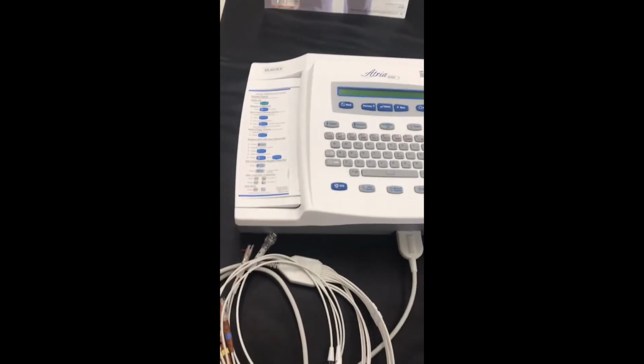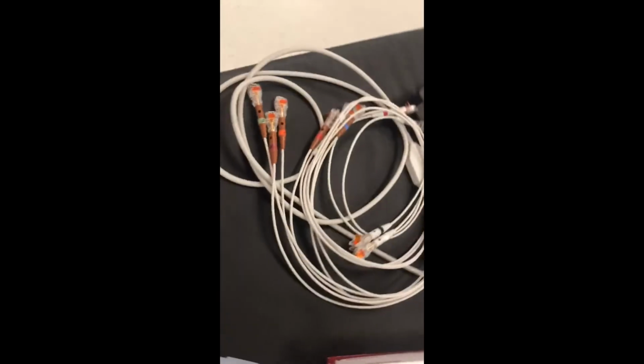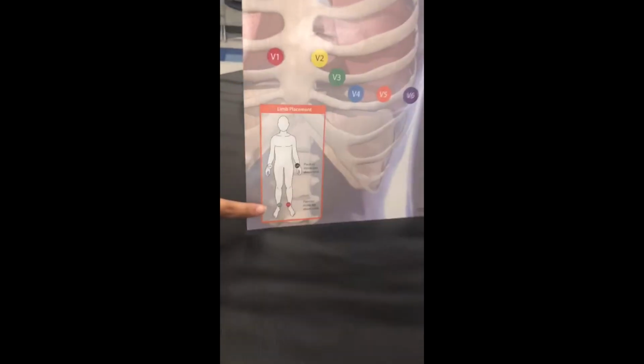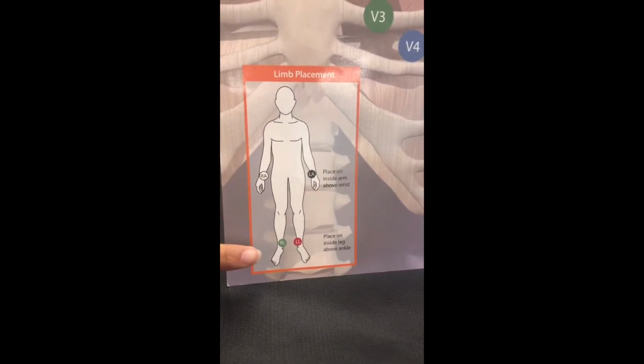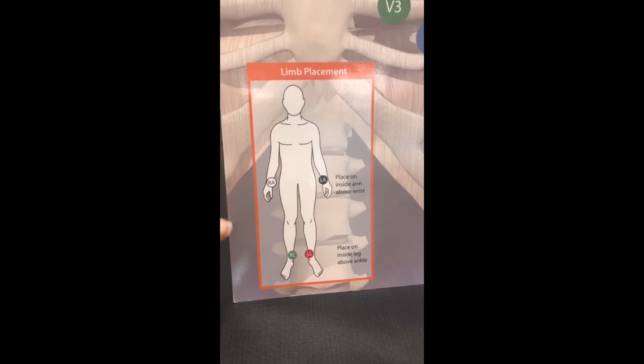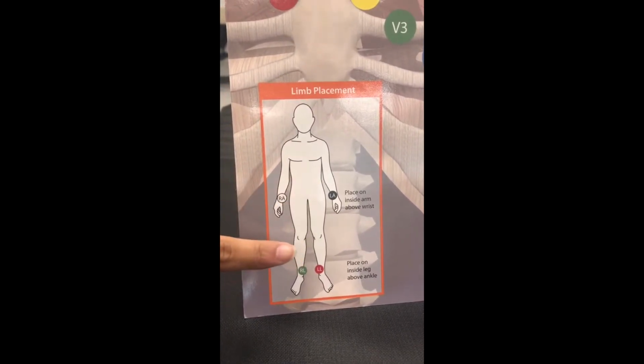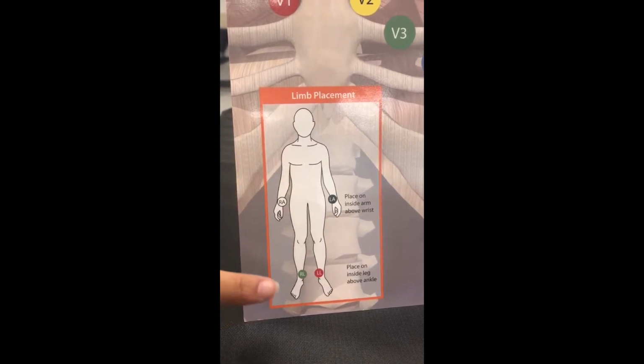These are the leads. The leads are properly placed as described earlier. There's an acronym that we use to help. White on the right, snow over grass, so you have white over green, which is your right arm and right leg. Smoke over fire, which is black over red on your left arm and left leg.